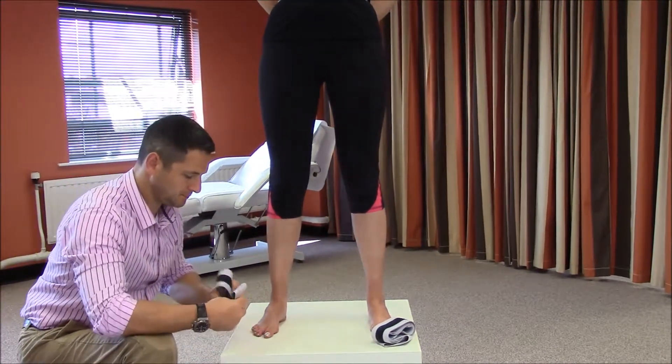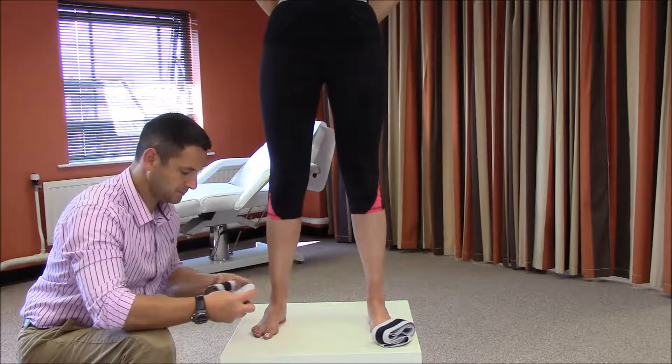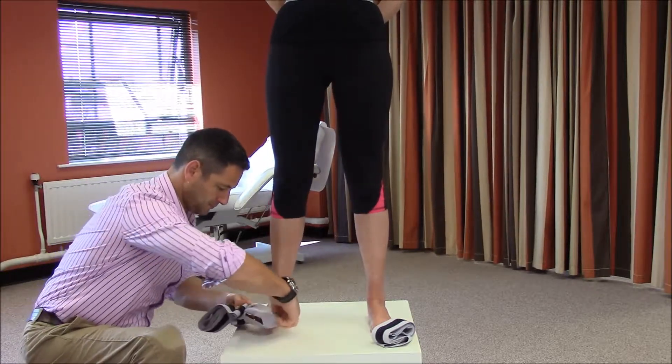Once fastened securely, insert the right foot into the instep stirrup and wrap laterally over the instep and around the ankle.